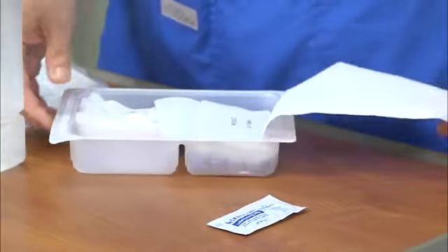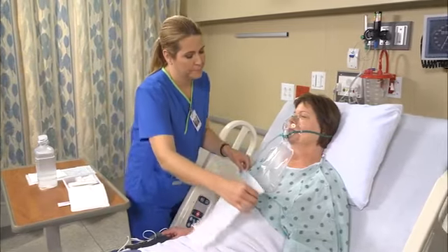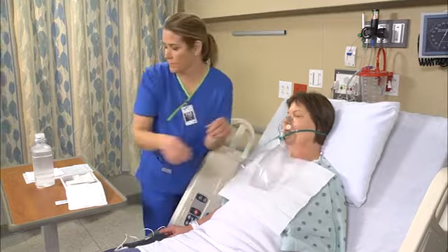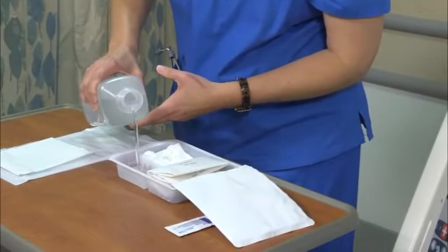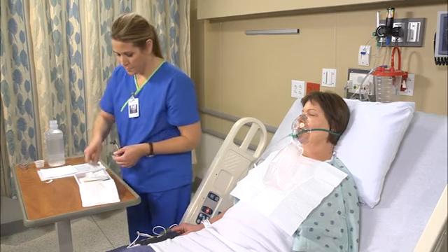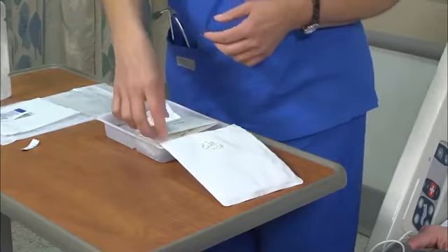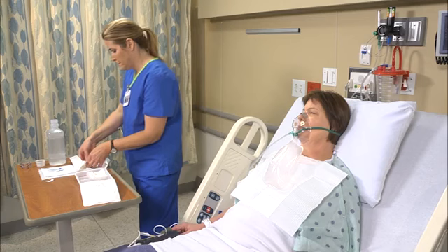Now prepare the suction catheter by opening the suction kit or catheter using aseptic technique. If a drape is available, place it across the patient's chest or on the overbed table. Fill the tray compartment with about 100 milliliters of sterile normal saline solution or sterile water. Open the water-soluble lubricant and squeeze onto the open sterile catheter package. Be careful not to touch the package.